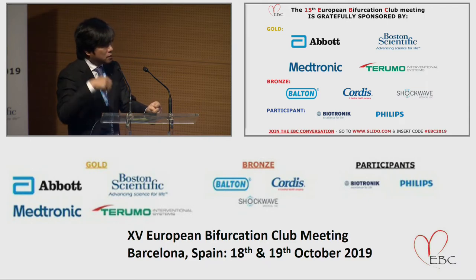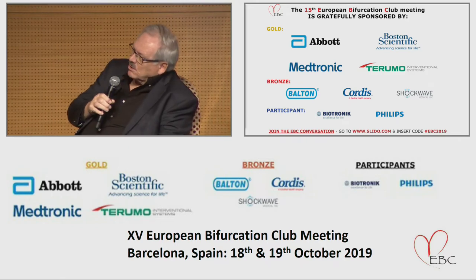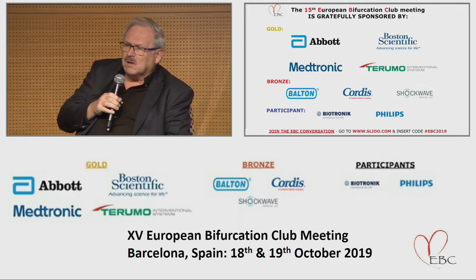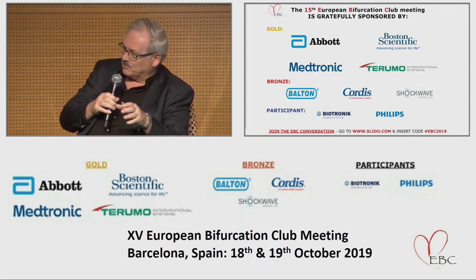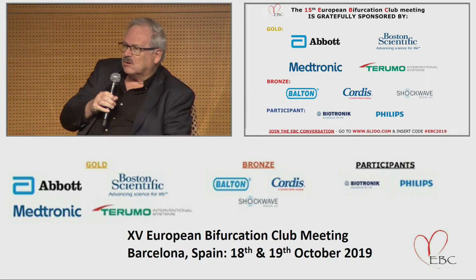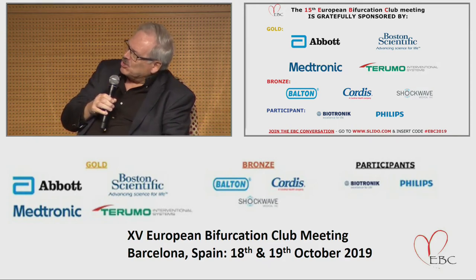This reminds me a little bit of the story of the coverage of the struts. We spent a lot of time, of course, on autopsy data, which had a very high denominator, and it seems that non-coverage was really related to thrombosis. But we as clinicians had a hard time translating any numbers of non-coverage into stent thrombosis.